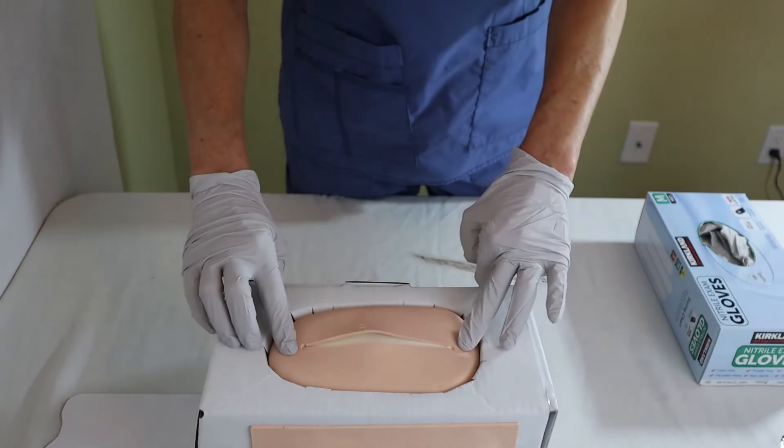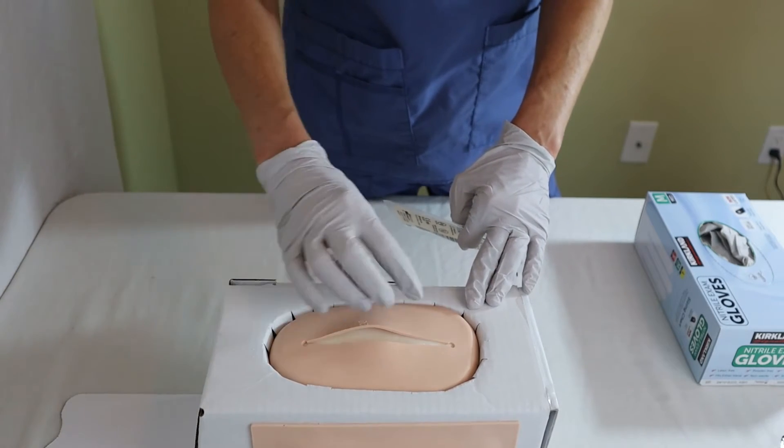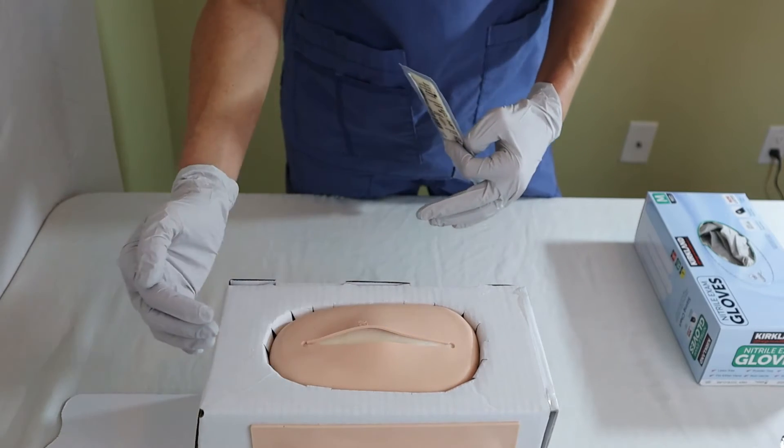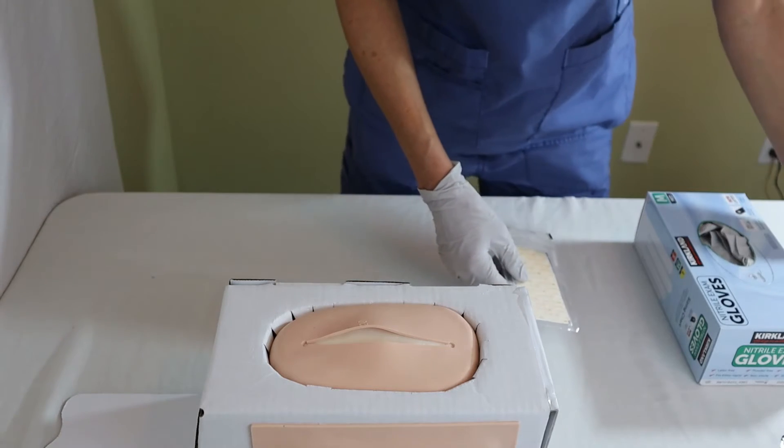In this case, the wound here is not very properly approximated, but we'll say for purposes of this video that it's better approximated and the staples or sutures have been removed.